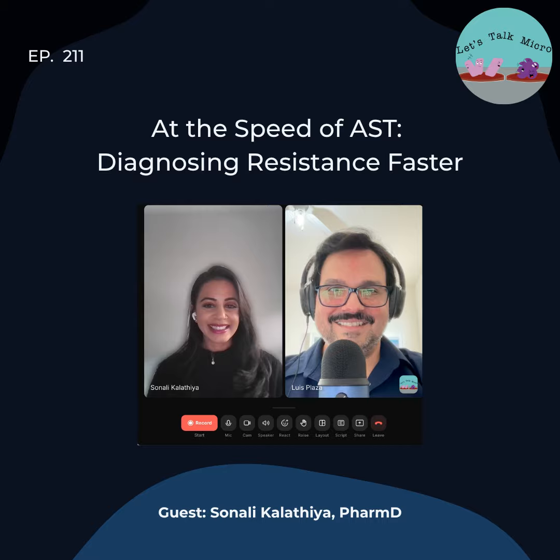So labs will also need to establish a communication pathway where the results of the test are reported to clinicians, whether that's a text or a page or some sort of alert in the EHR. And I think this is really, really important. It really highlights the collaboration between the lab and the antimicrobial stewardship program and the clinicians. That's really critical to maximize success of bringing on a test like this.